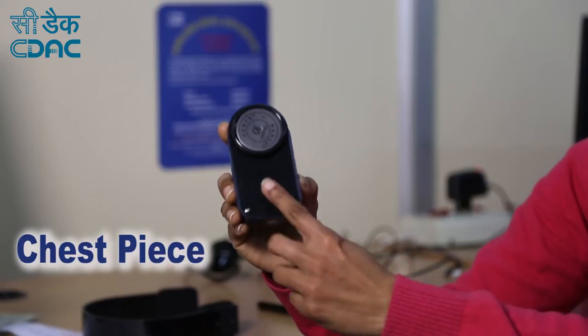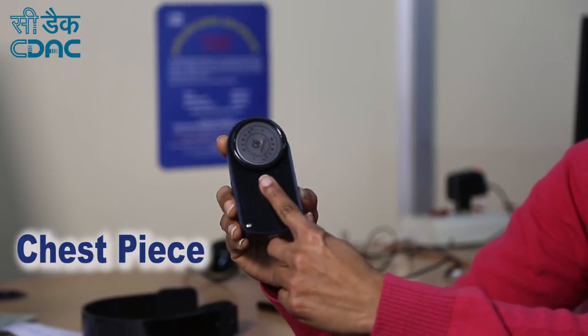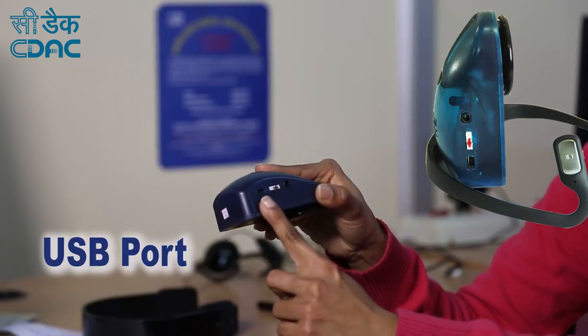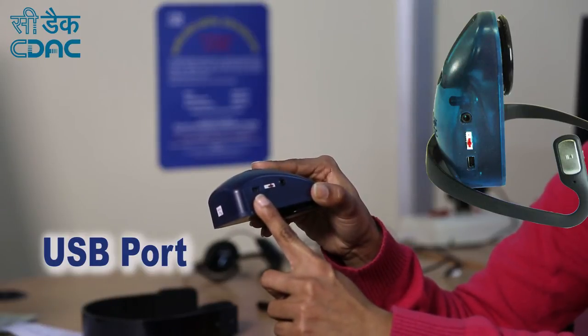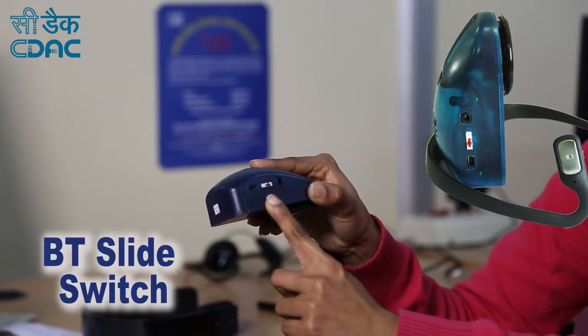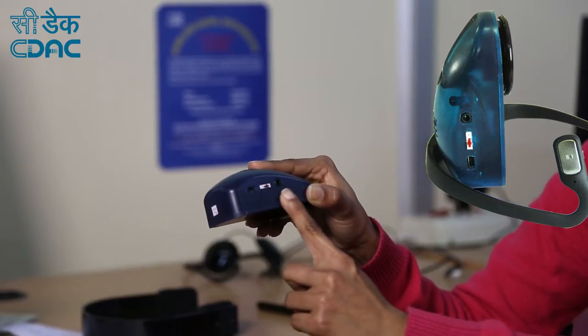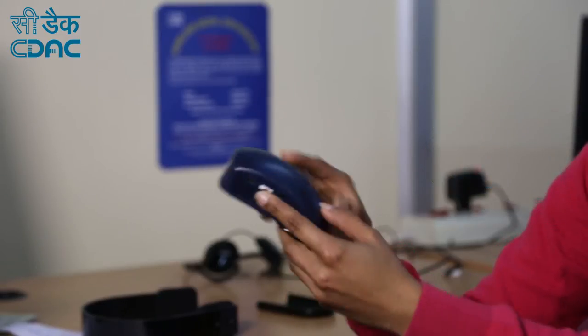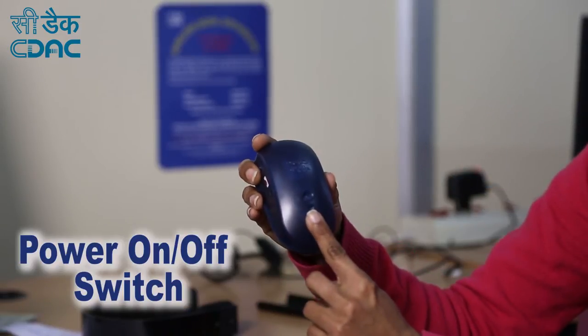To open the device, slide the base cover. Let me go through the various parts of the device. This is the chest piece. This is the USB port for charging the device. This is the Bluetooth slide switch for connecting a Bluetooth headphone. This is the audio jack for connecting a wired headphone. This is the main on/off power switch.